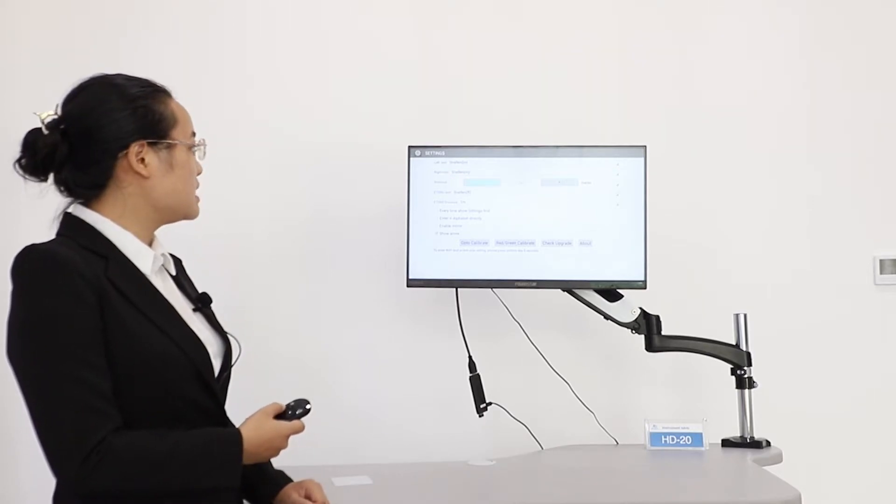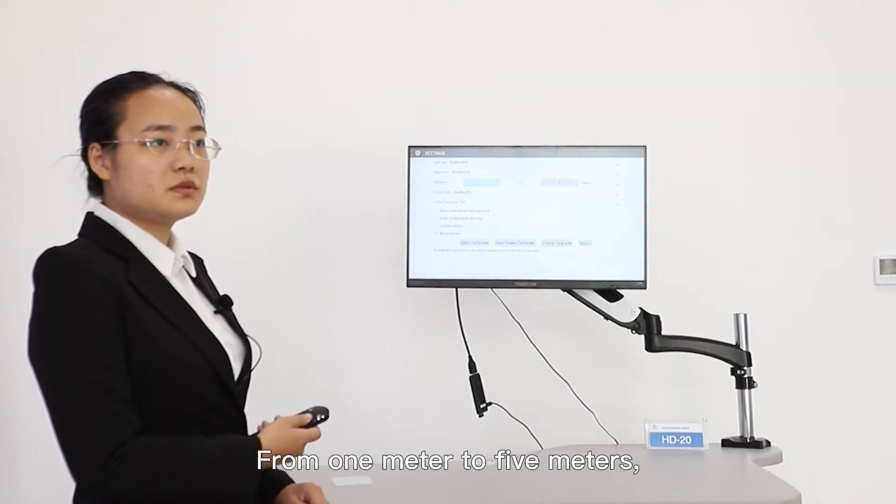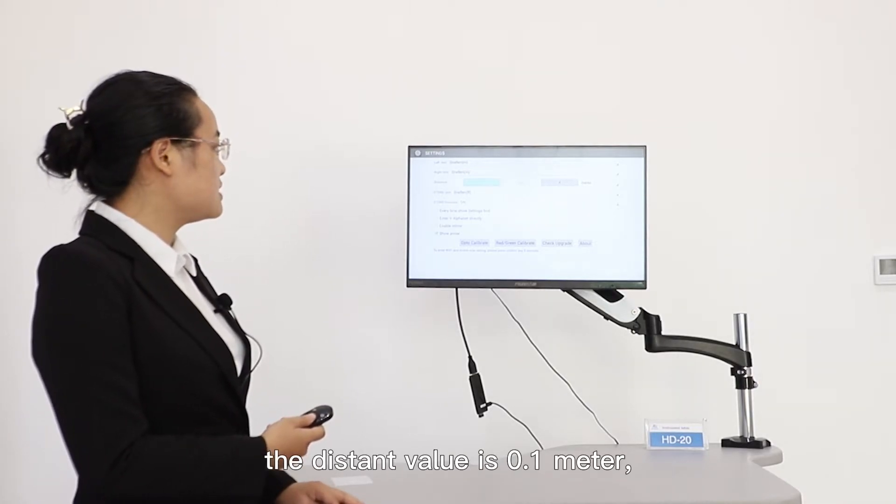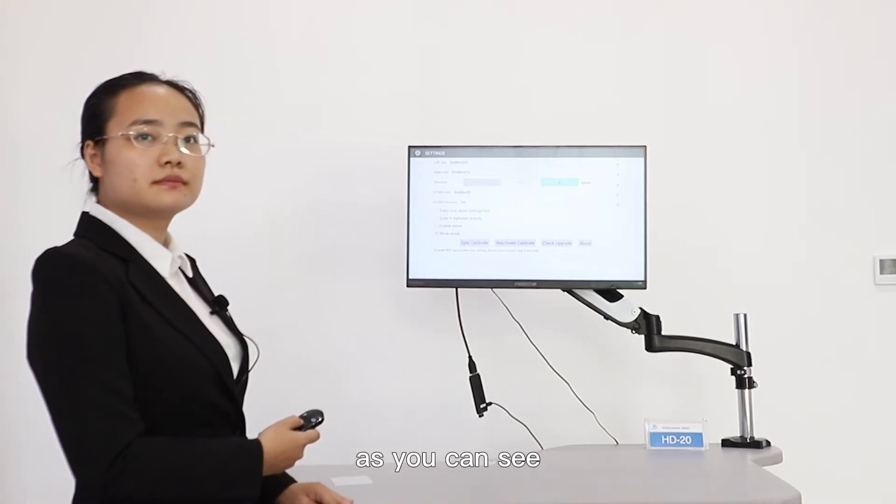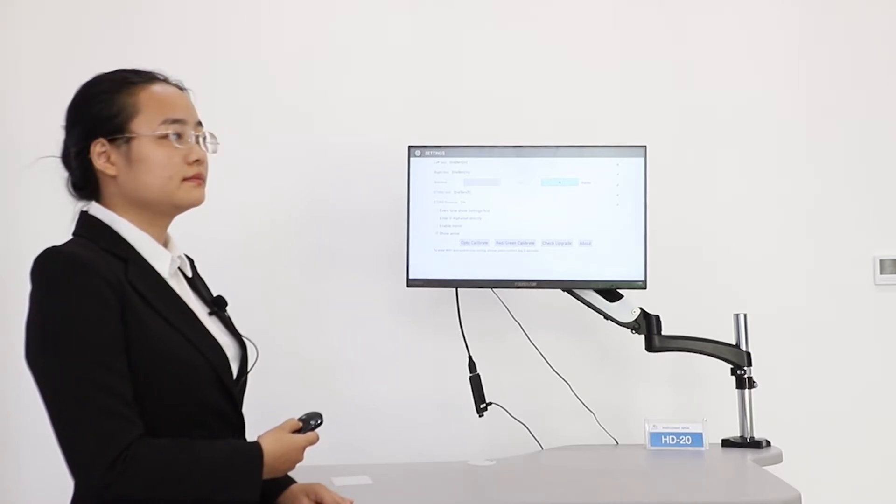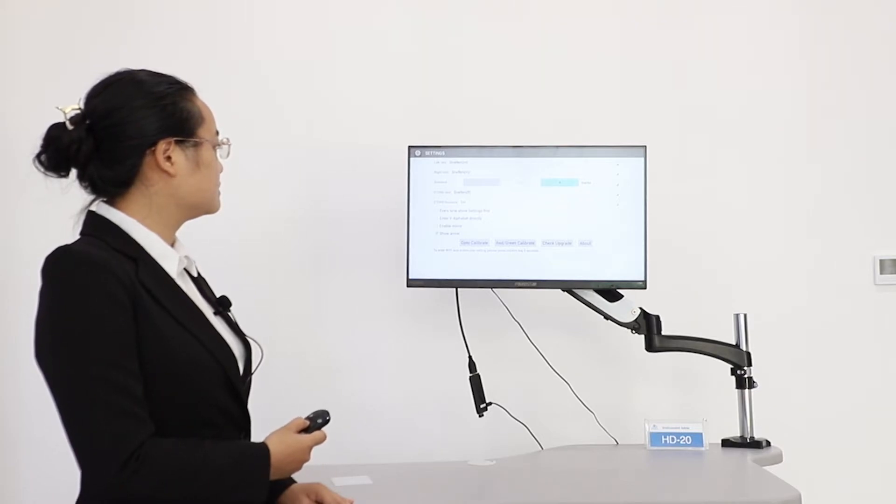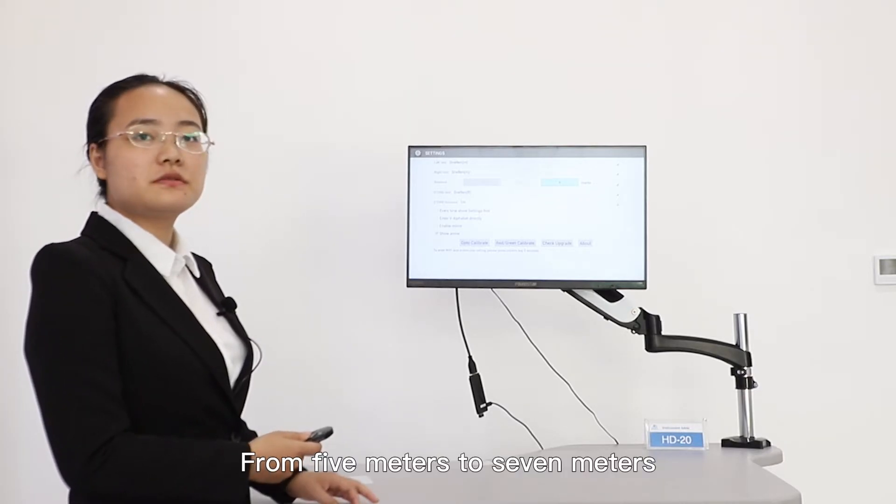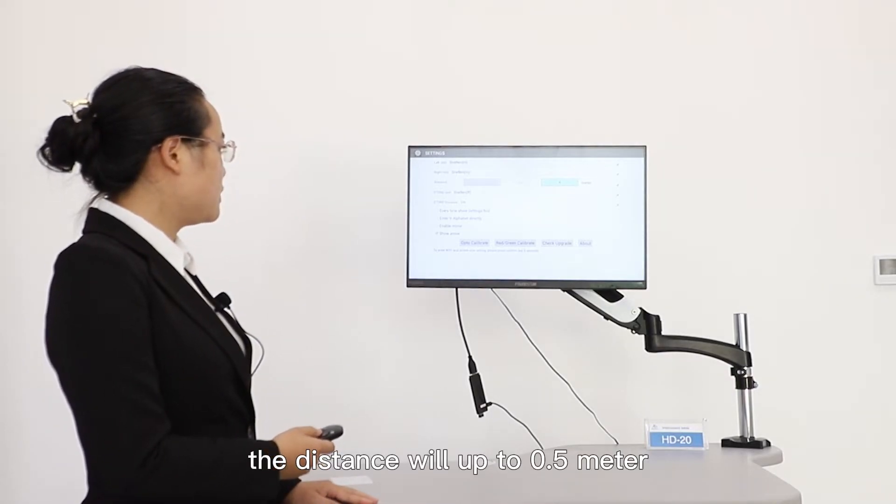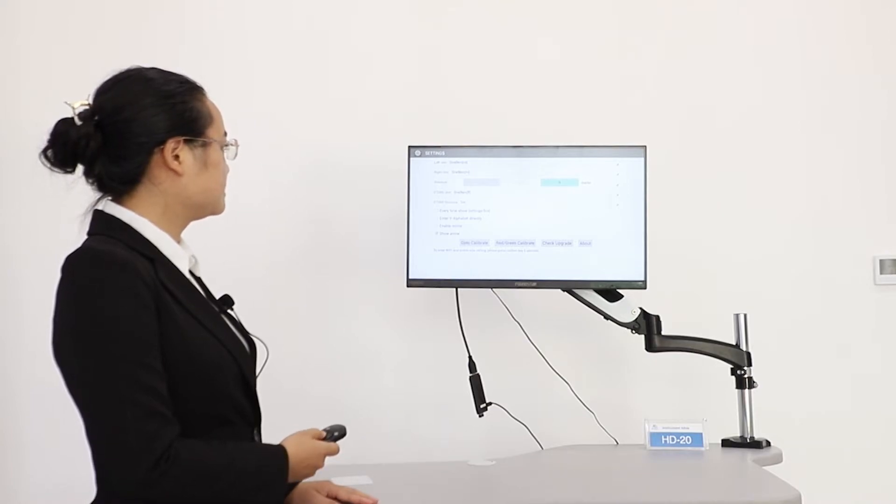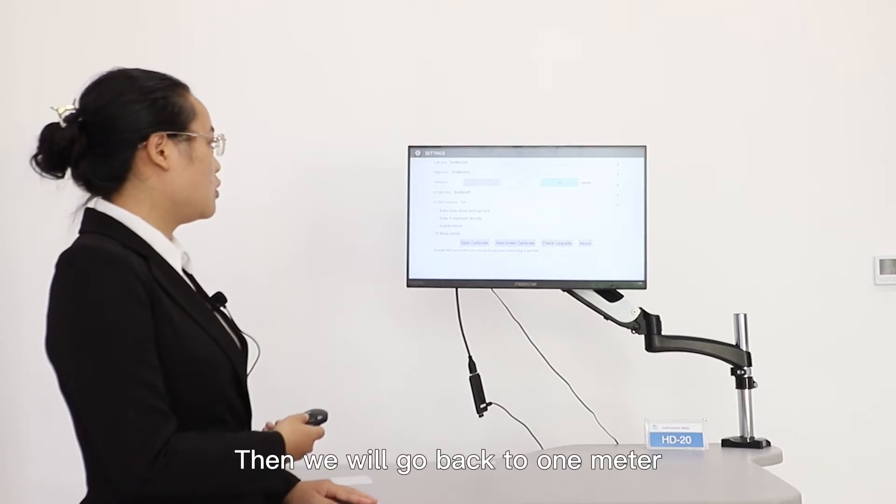For the working distance, it's from one meter to seven meters. From one meter to five meters, the distance value is 0.1 meters. From five meters to seven meters, the distance goes up to 0.5 meters, then you will go back to one meter.